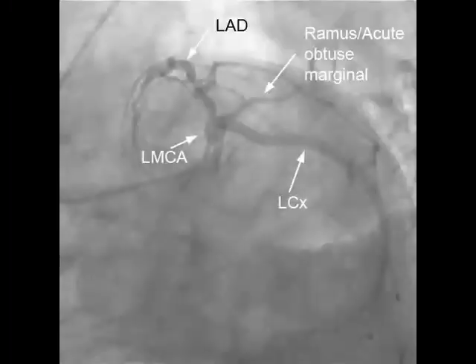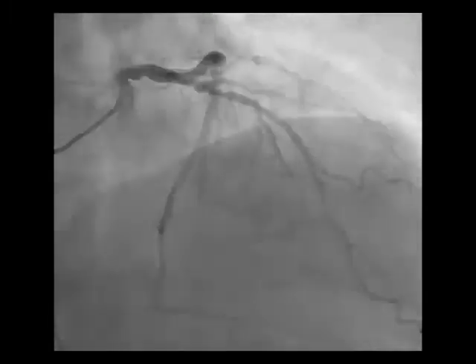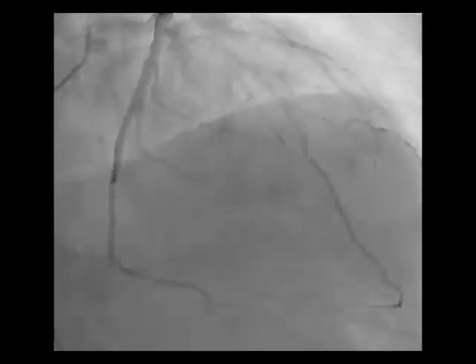At this point in the procedure, coronary angiography begins, the details of which are highlighted in another video tutorial. In this example, an intermediate stenosis in the ostial proximal left anterior descending artery will be further evaluated by fractional flow reserve.